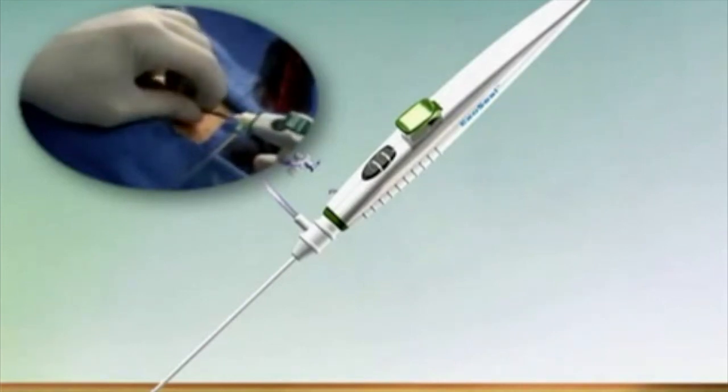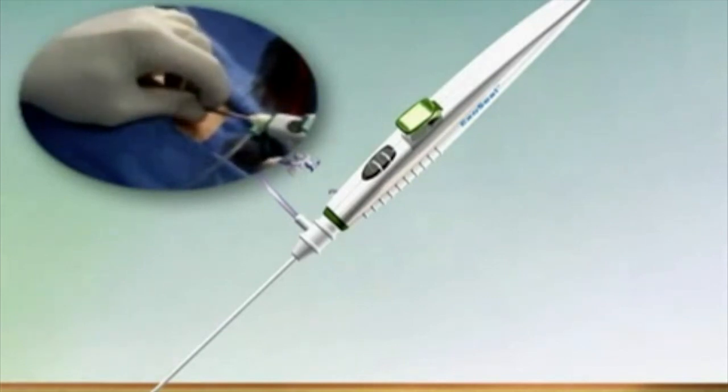The reduction in pulsatile flow is an important visual indicator that the device is approaching the correct position for plug deployment.